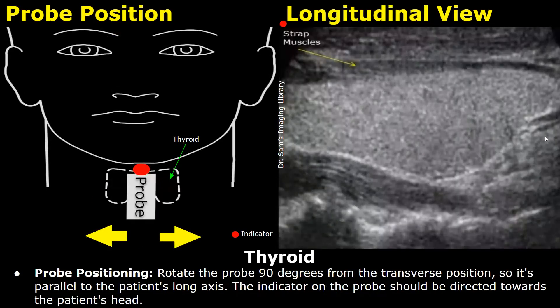After that, rotate the probe 90 degrees from the transverse position to scan in the longitudinal plane. The indicator should be towards the patient's head, and you will get this type of image.